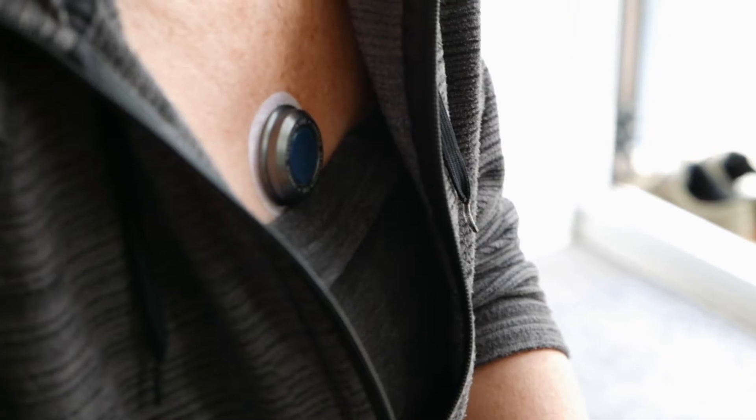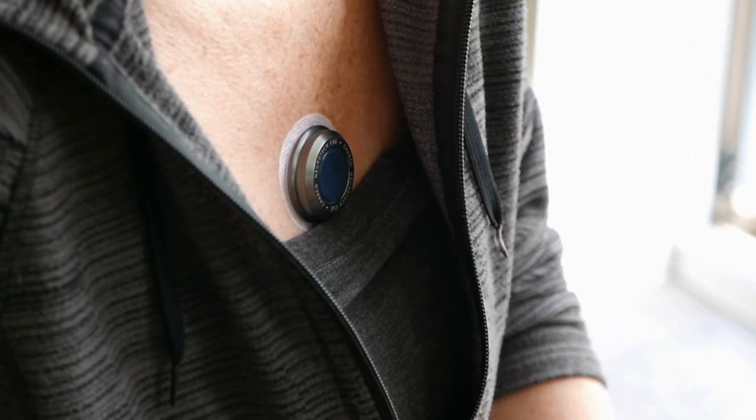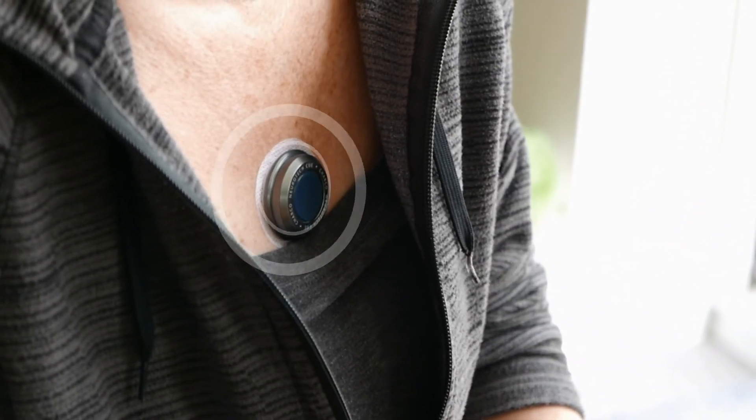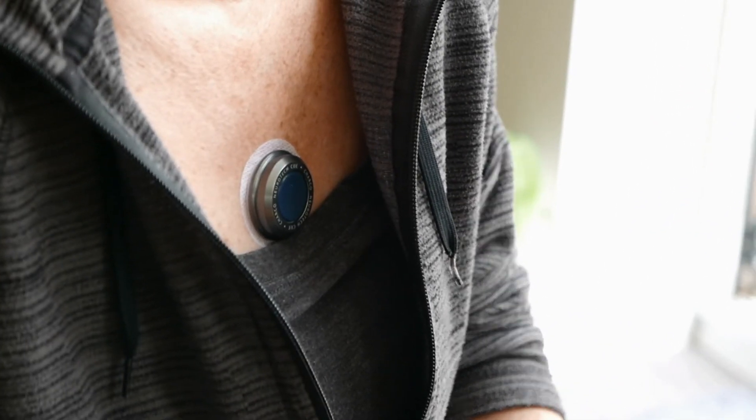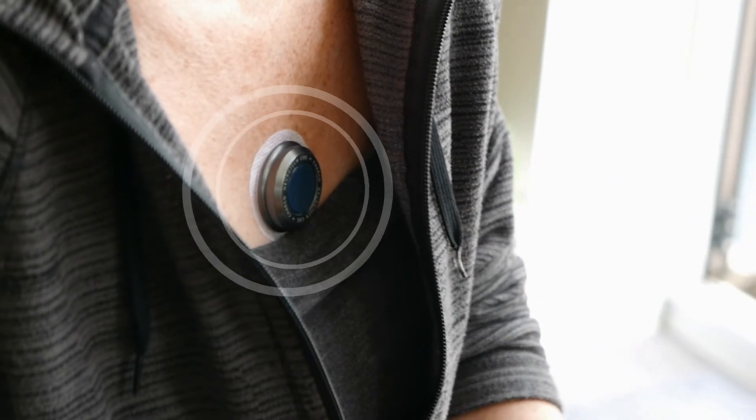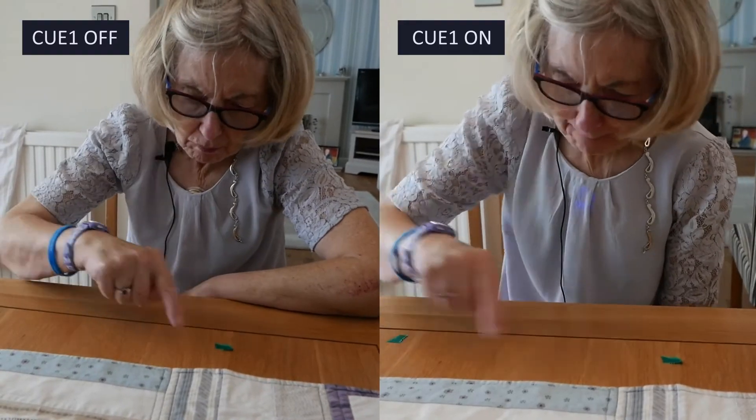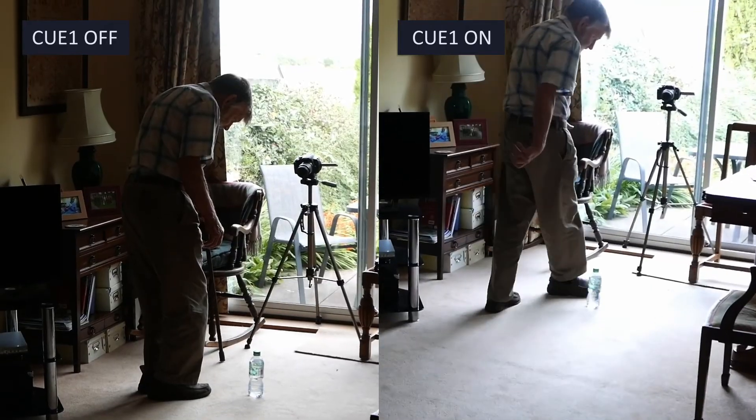The CUE1 is a non-invasive wearable device that uses vibration to alleviate a range of Parkinson's symptoms, including slowness and stiffness of movement and freezing of gait.